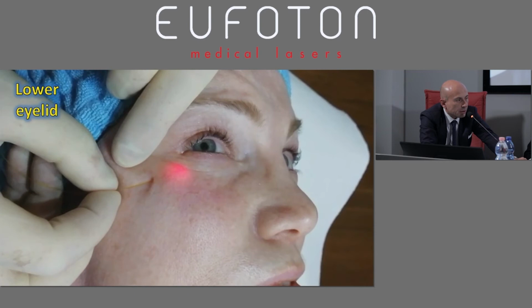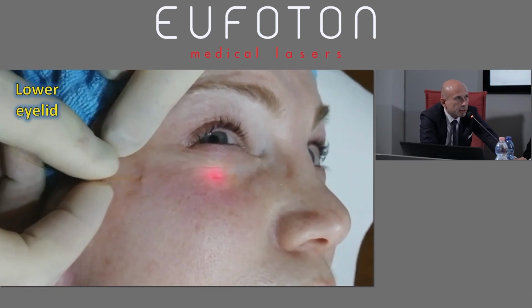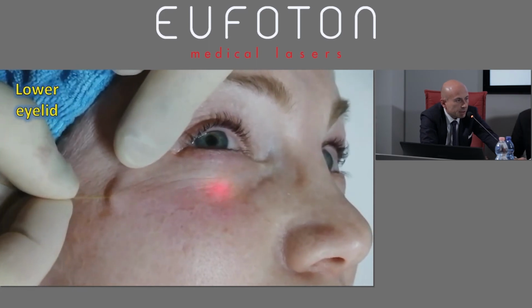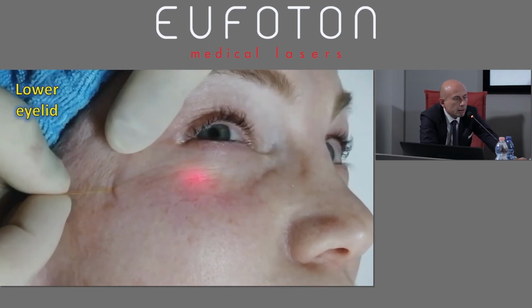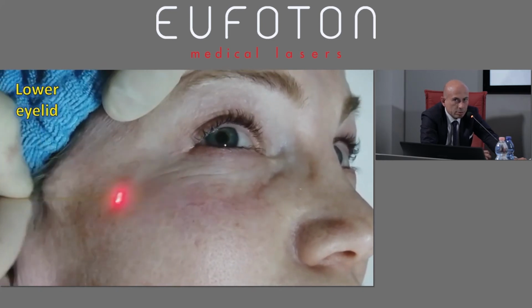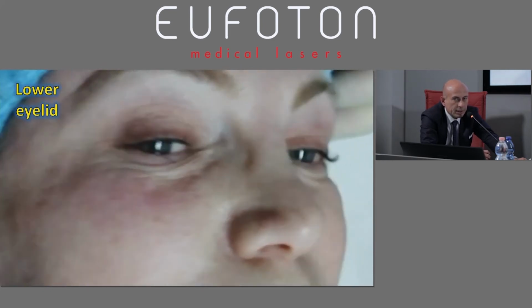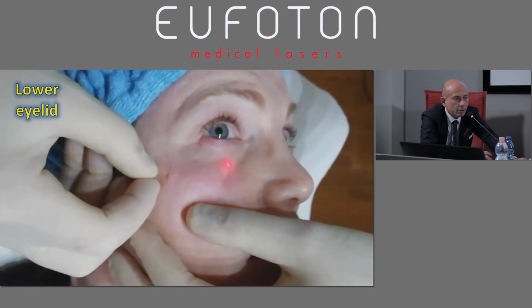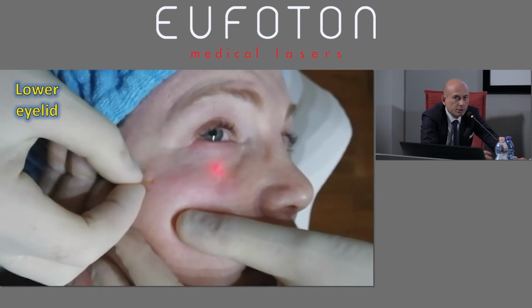So multi-use fibers still exist, and we use them just in liposculpture or laser lipolysis with cannulas, because they are coated by the metal of the cannula itself, thus avoiding breakage. Also in the case of bigger gauges, a 1000 micron fiber is indestructible.